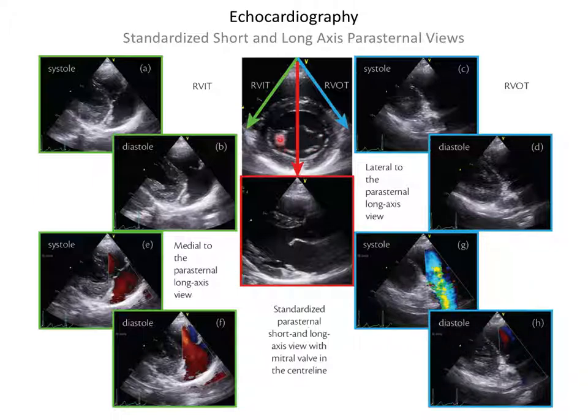And these signals here, so this is the left ventricle in the short axis view, and we've tilted the transducer so that we're up towards the valve plane, and we're seeing these valve leaflets here, and they're open at this point. So these valve leaflets are the mitral valve. Okay? And then we'll see, as we go higher, you would see the outflow tract and the aortic valve, but these are the mitral valve. That's these leaflets here. Okay?